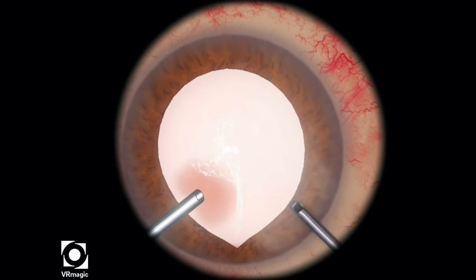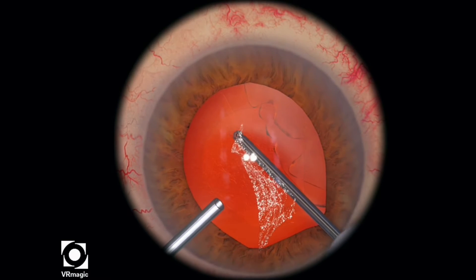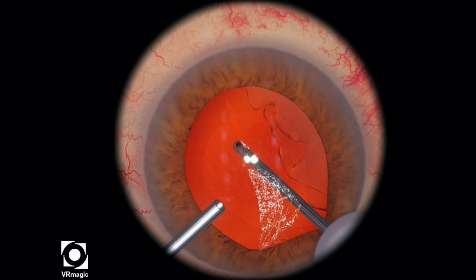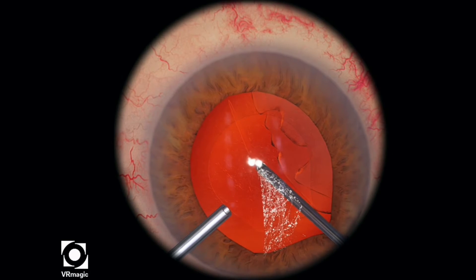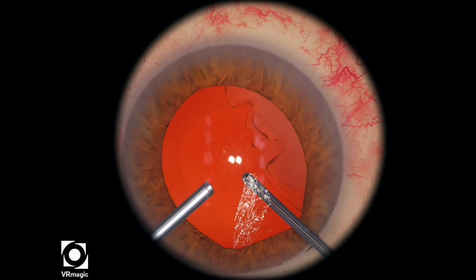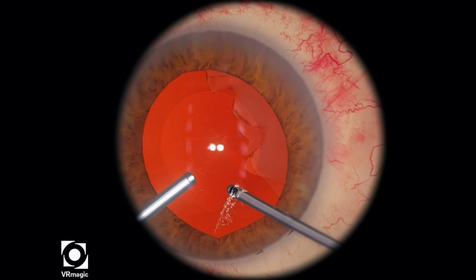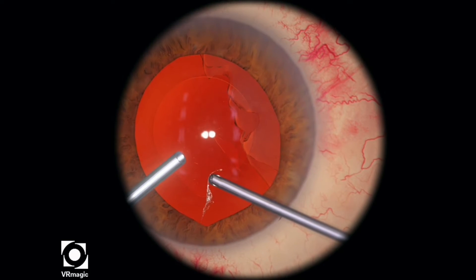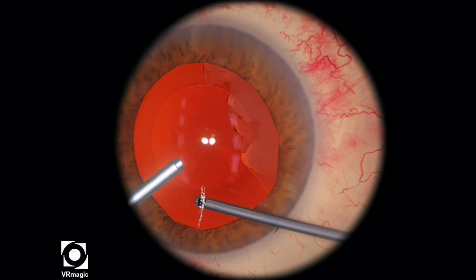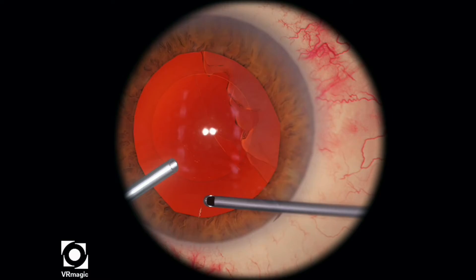What you have to do is deal with the posterior capsular rupture where vitreous is now entering into the bag. So you first stain with triamcinolone, and then one of the tricks for beginners is that you actually want to stick your vitrectomy cutter deep posterior to the posterior capsule. You want to go behind the posterior capsule and then try to slowly cut from the bottom to the top. The reason is that if you don't get all the posterior vitreous, you may pull some of the vitreous from behind the posterior capsule to inside the bag, and the machine will deduct a lot of points. So if you start from the very bottom, you'll avoid pulling or traction on the vitreous and bringing it forward.